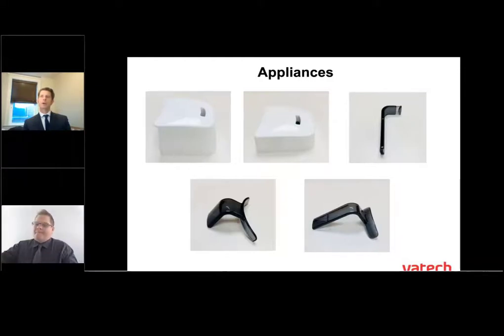And that's going to be real important to make sure we're doing that. So go ahead and put that in there and just put their chin up against there. You can have them just gently close on their back teeth. I have offices using this specifically if we are capturing our airway, and we're going to go into that next. So those are our appliances we're going to use.